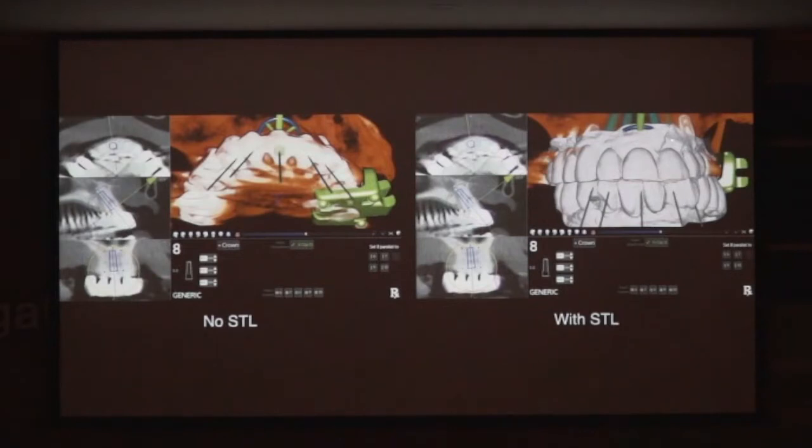When you're planning now, you could just take a lasso and get rid of the entire DICOM file and just plan with the emergence through here and these 2D views, which is what I do quite often. Now, if you lasso something and you cut it away, you can put it back with the negative lasso. And so anything you remove from the CT, you can put it back. If you wanted to just remove this flash here, you just go around it with the lasso and click it and it'll disappear. I don't know if any of you used the old implant software where you had to segment the images and how much time that used to take. It drove me crazy. I hated doing that. With this, you don't need to do any of that.